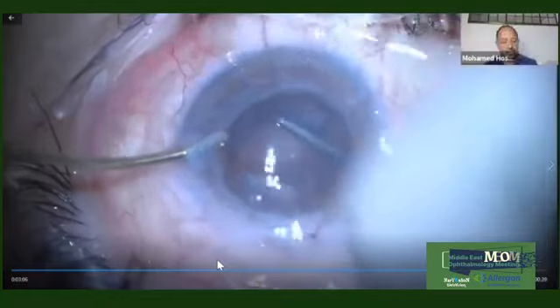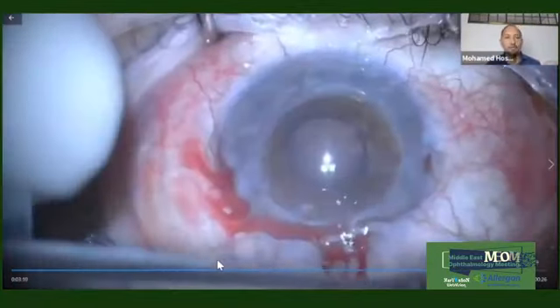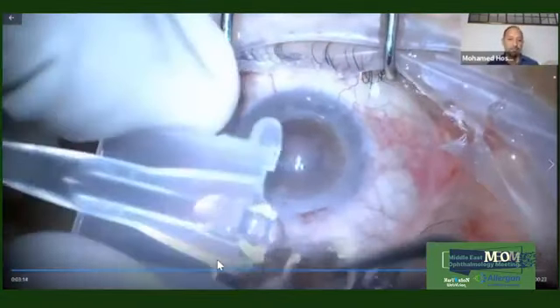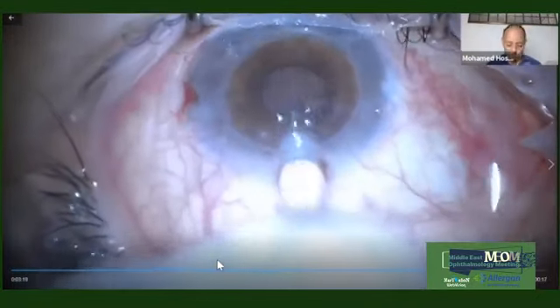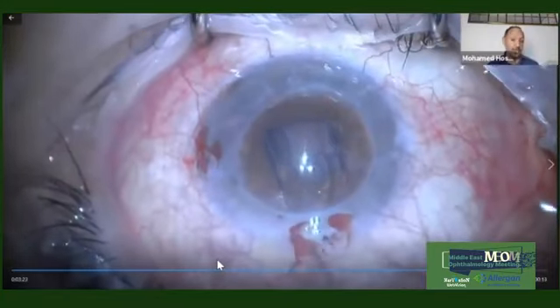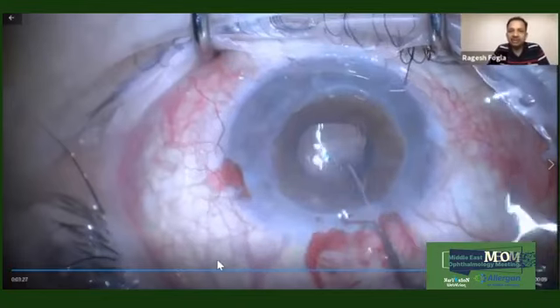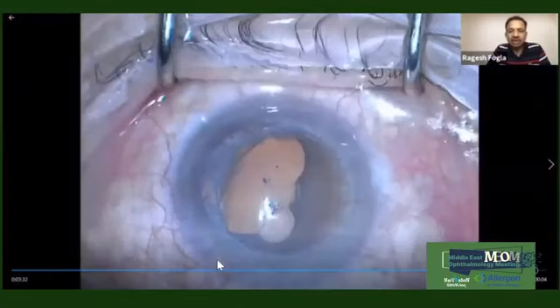Yeah, we actually did a PhD thesis on this specific matter, and we combined both modalities, but it was only a 1 month difference between the astigmatic keratotomy and the topography-guided treatment. And we had very, very good results in these patients. Yeah, so even I do that. Sometimes I have an astigmatism of 11 diopters, which obviously you cannot correct using surface ablation.